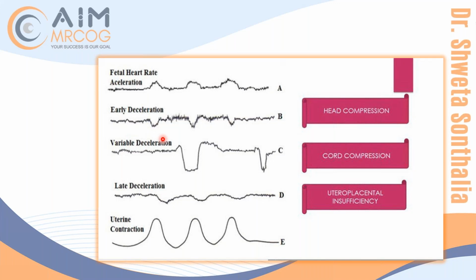So also keep your brain open that somebody is 4-5 centimeter, you are not going to get early deceleration. So most likely it is variable if it is at 4-5 centimeter. But if it is at 7-8-9 centimeter thin cervix, then it could be head compression. And then we apply our knowledge of how it looks like and things like that. So either late first stage or second stage, you see the early deceleration, and maximum 5%. The incidence of early deceleration is only 5%.